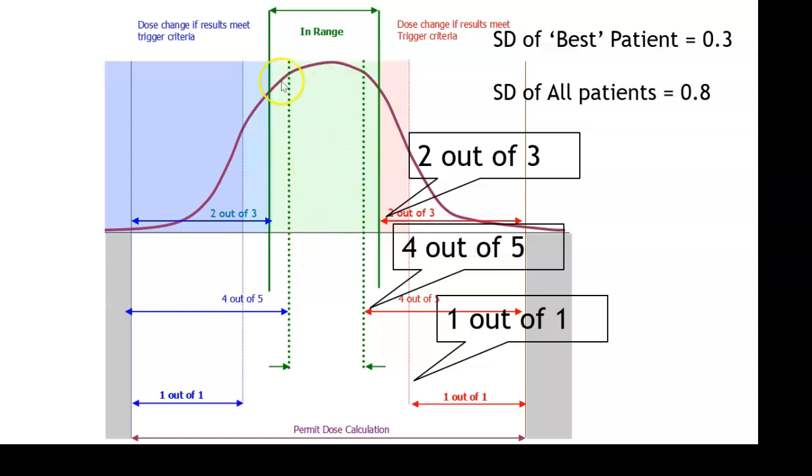So for a normal well-controlled patient, most of their results are going to fall here, but a one-off that's low but still above 1.7, or is high but still below 3.3, might purely just be down to chance. And in that case, it's just as likely the next INR result will be right in range again.